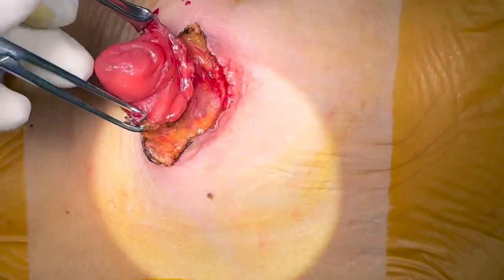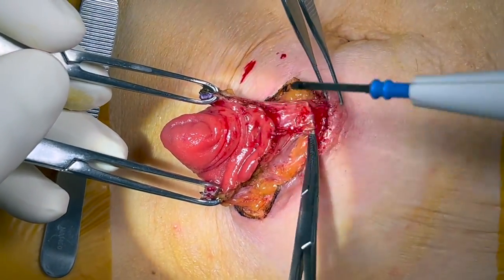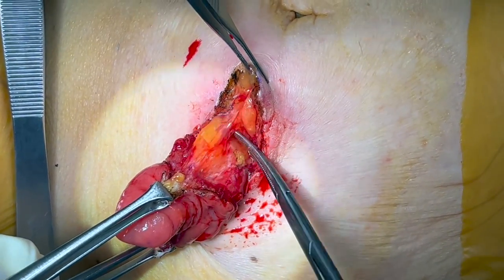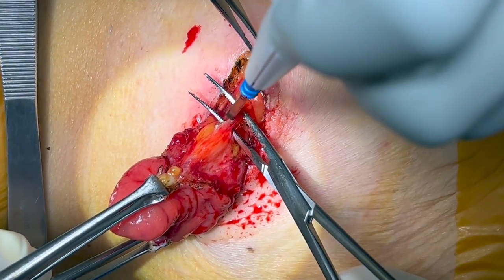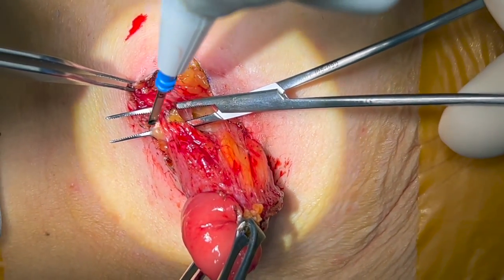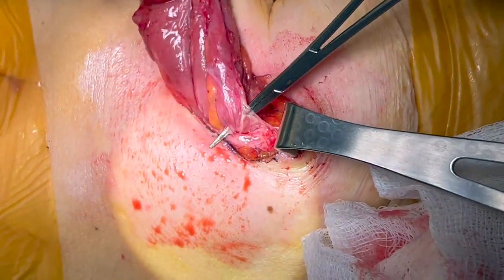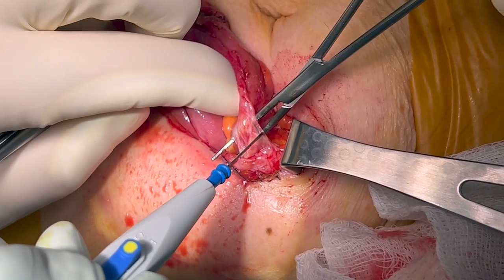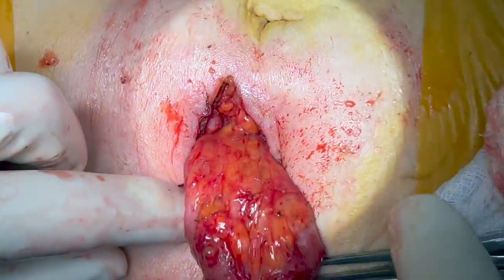Allis clamps are placed at the skin edges and used to retract the stoma and expose the interface between the serosal surfaces of the intestinal loops and the subcutaneous tissues. A circumferential dissection is performed and carried down until the anterior rectus sheath and muscle are identified, in this case with a fine-tipped snap and electrocautery, but it is also possible using Metzenbaum scissors. Care should be taken to avoid injury to the bowel serosal surface and stoma mesentery during dissection. Richardson or Army Navy retractors can facilitate exposure and visualization.